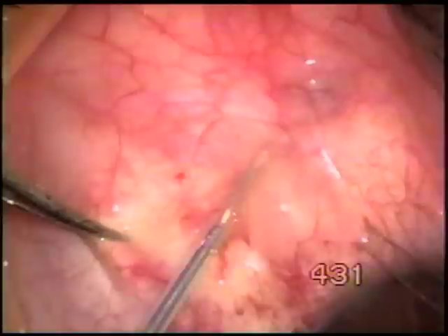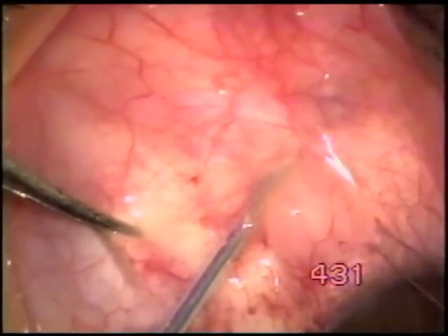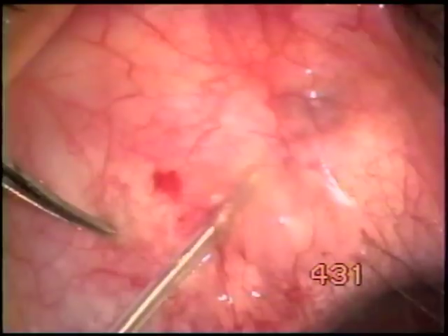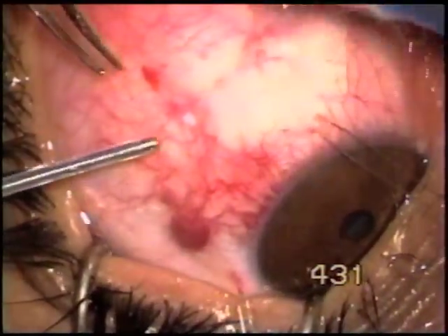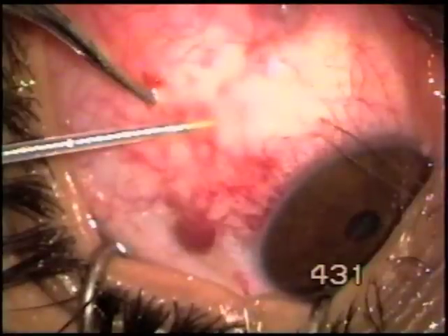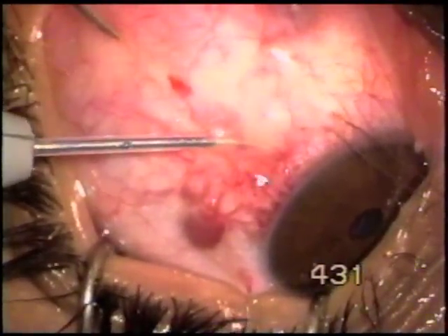Just get in under the conjunctiva and approach the tumor — the vascular tumor. Activate the fugo blade at very low energies, and this tissue just disappears.